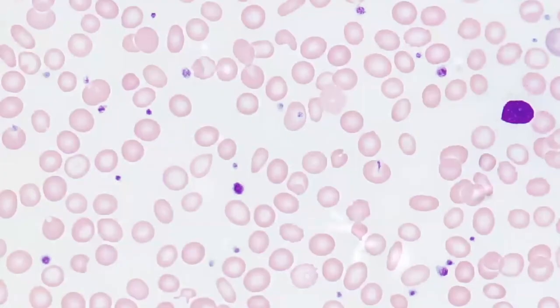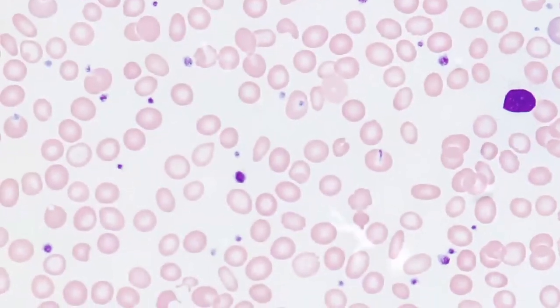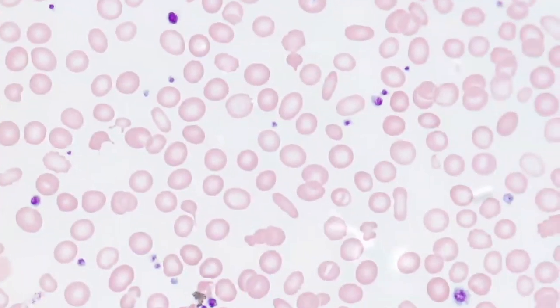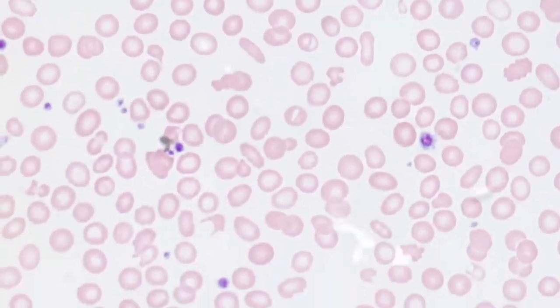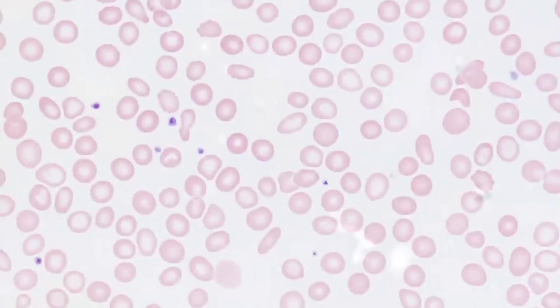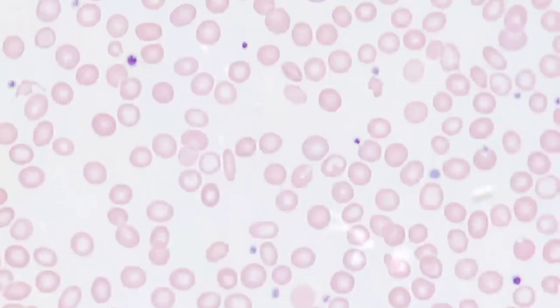And lastly, I just want to comment on the number of elliptocytes seen in iron deficiency anemia. These are often called pencillate cells due to their skinny and elongated morphology. And here, as we scan around, you can see a number of these pencillate or elliptocytic cells.